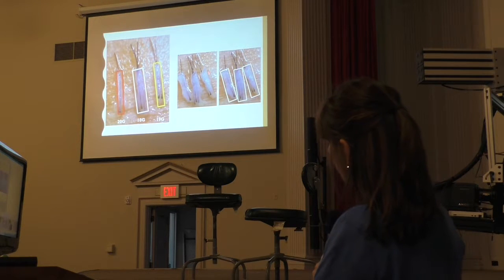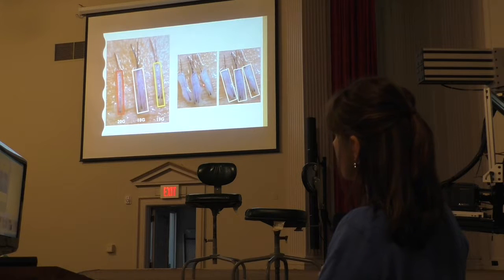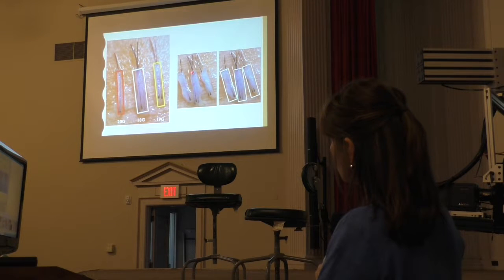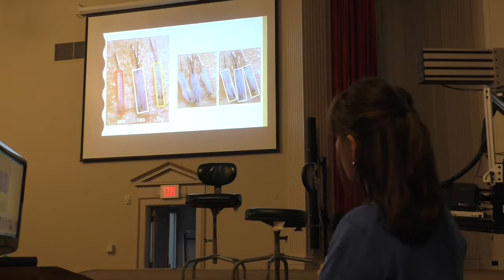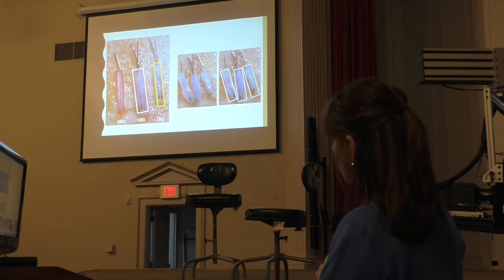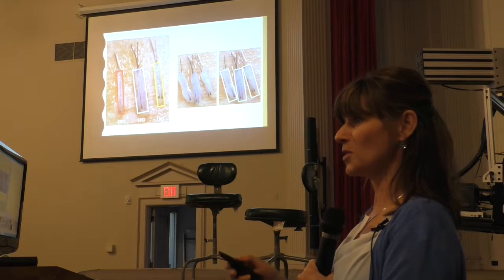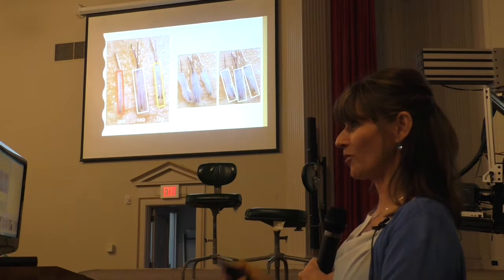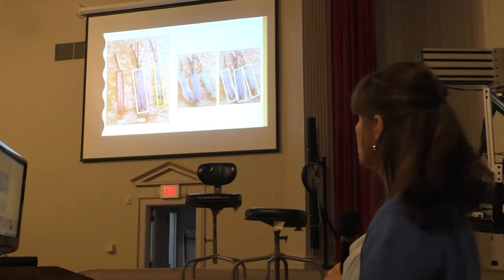So what I'm trying to show with this is that trimming is important because the graft has to fit into your size site. If you decide to mix 2 and 3 hairs and place them in the same size incision, then you have to match to the bigger graft, because otherwise you will cause a compression. So you match it to the bigger graft, then these can be mixed. This one has to be trimmed and fit in a smaller site. As long as there's agreement between you and your assistant, it's a creative process. It could be very fun if there's communication between all of you.